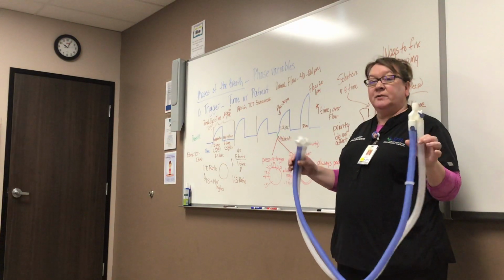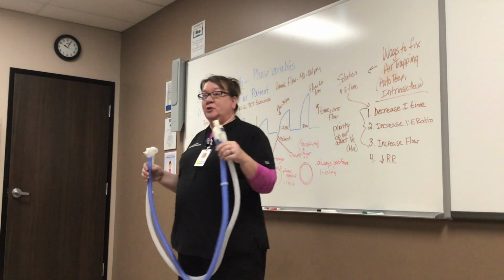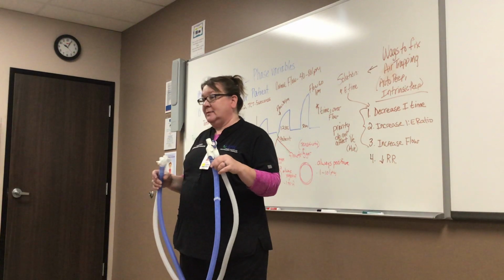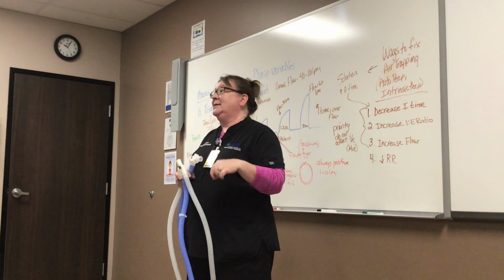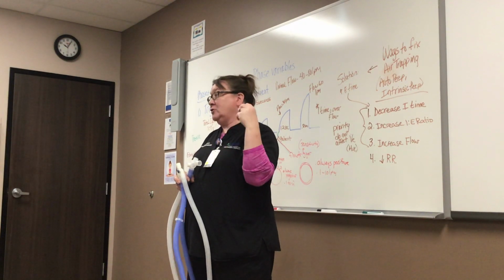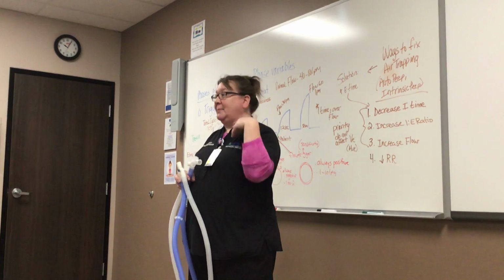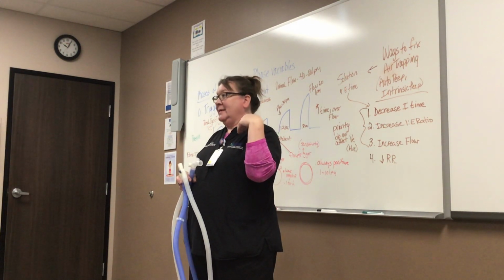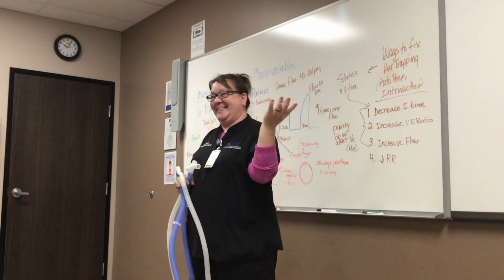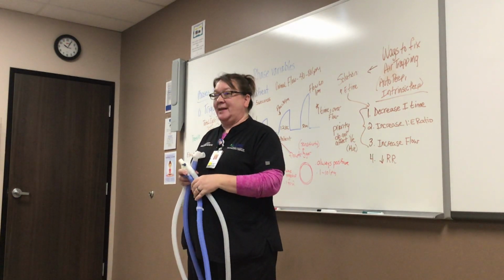So I compare this to a milkshake. You got a milkshake and you go put your straw in it, and the first time you take a sip, what happens? You gotta suck it through the straw, right? Super hard. That's like pressure triggering, because you gotta suck through the whole entire straw, every breath. But what happens the next time you go to take a sip? It's easier, right? Why is it easier? Because there's milkshake in the straw. Just like flow in the circuit. It's easier to trigger because of the same reason.